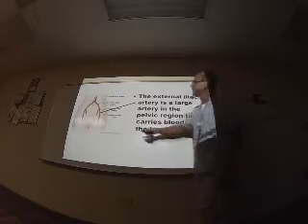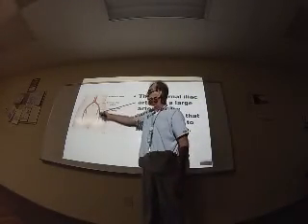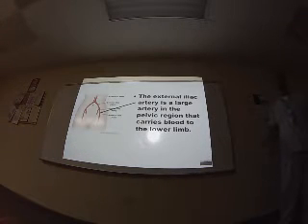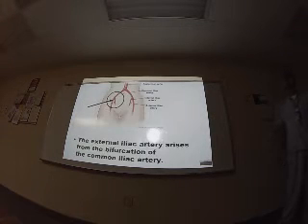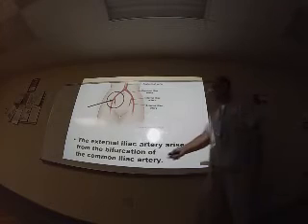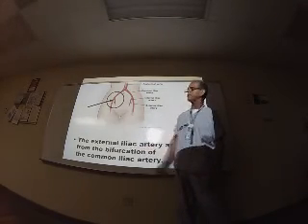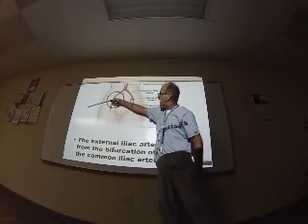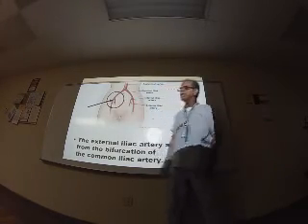Arterial of the lower limb is a very common protocol. You can see here the external iliac and the internal iliac, at the bifurcation of the common iliac. The external iliac artery arises from the bifurcation of the common iliac artery. Common iliac artery, bifurcation, external and internal.